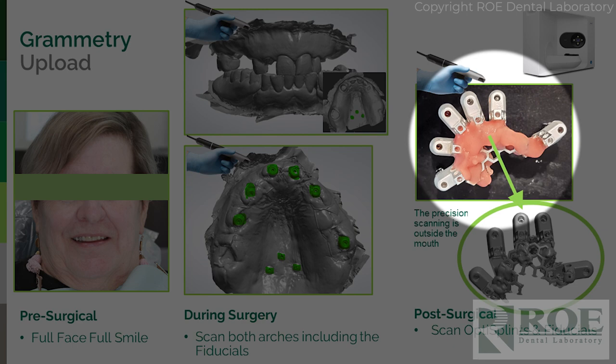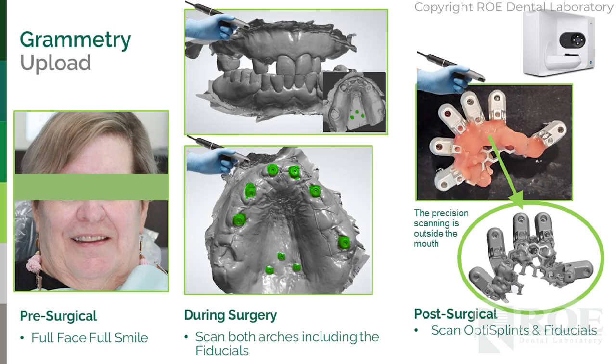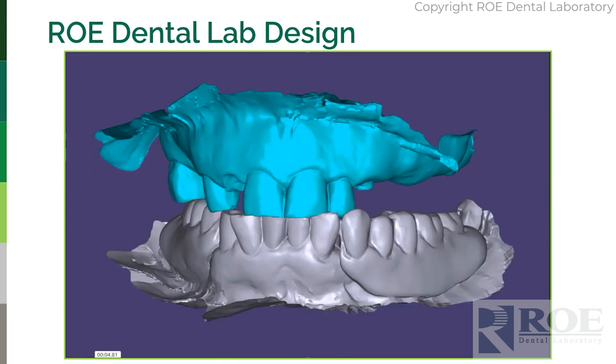If you scan the OptiSplint in the mouth, perfectly fine. Just also scan this, and then because we like the accuracy, scan the OptiSplint outside the mouth again. But what you see on this screen is what you're going to send. These files in a folder on our website, you'll upload. That's it. Please call us to discuss any of this. Once we have the records, we will design your case.